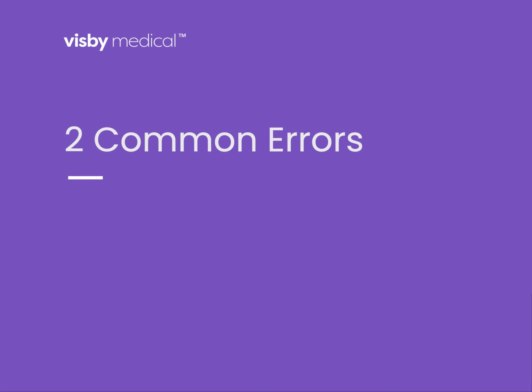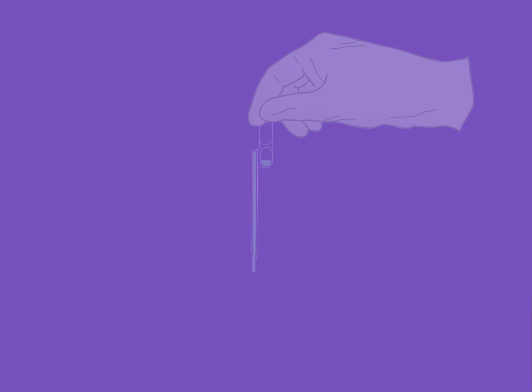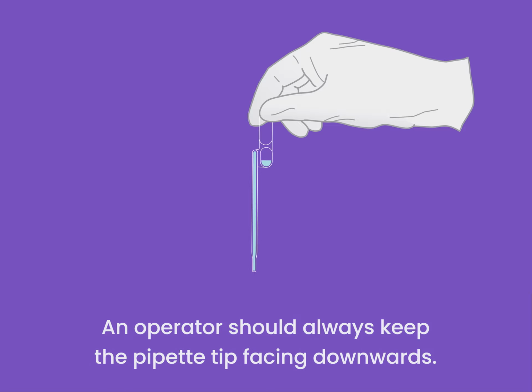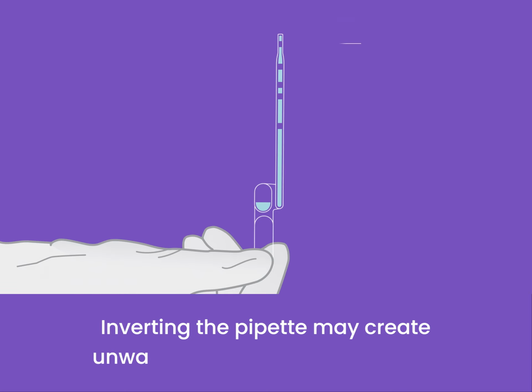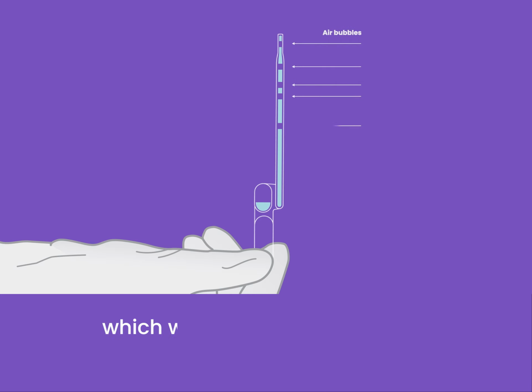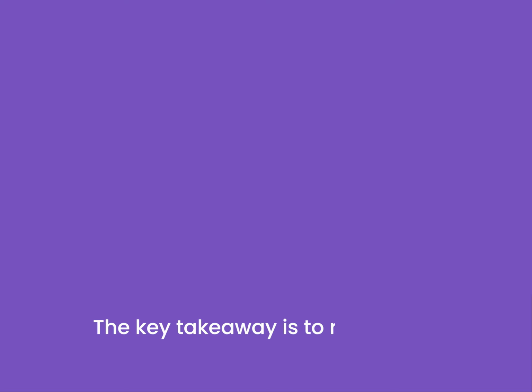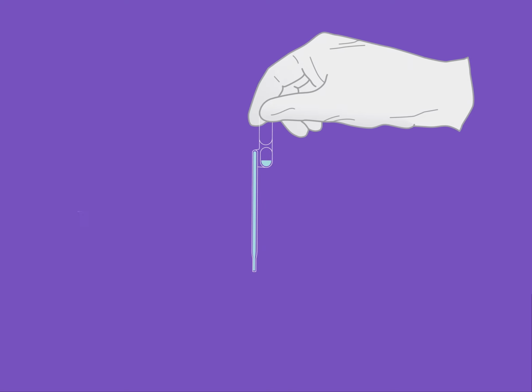We will now review two common pipetting errors. The first is due to inverting the pipette. An operator should always keep the pipette tip facing downwards. Inverting the pipette may create unwanted air pockets in the shaft, which would impact the volume being loaded into the device. The key takeaway is to remember to keep the pipette vertical until the sample is added to the device.